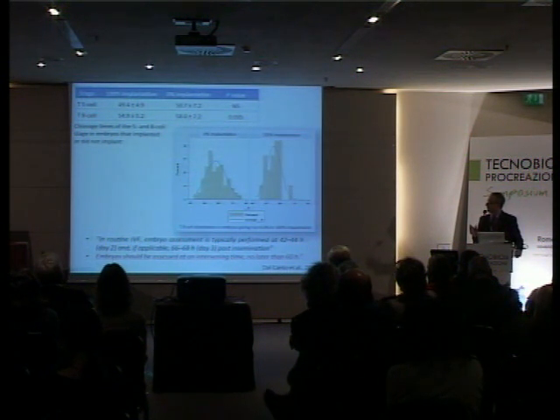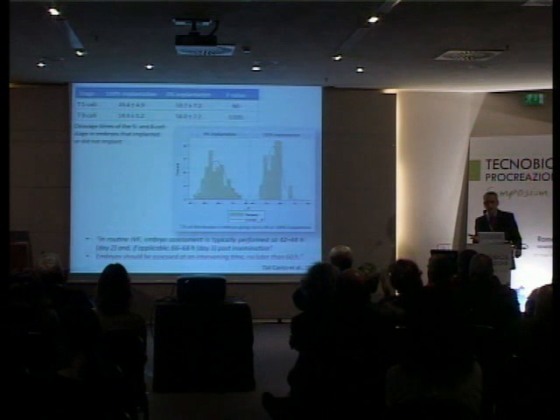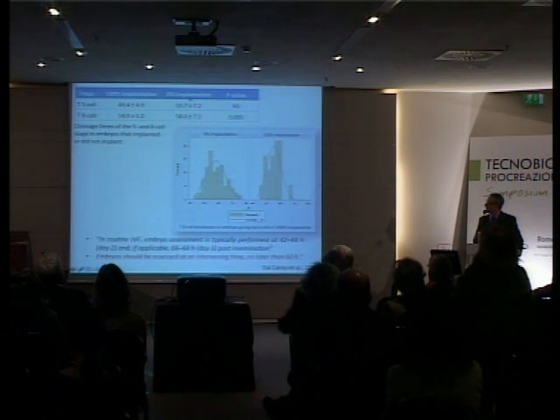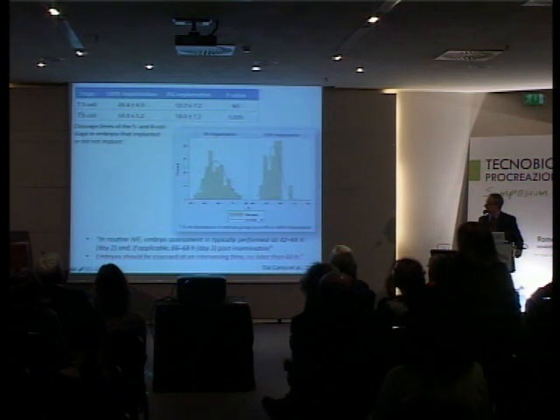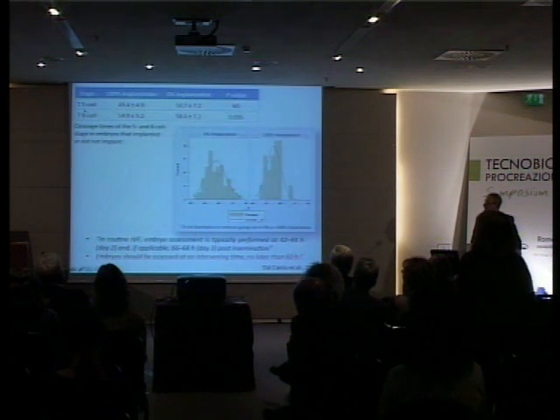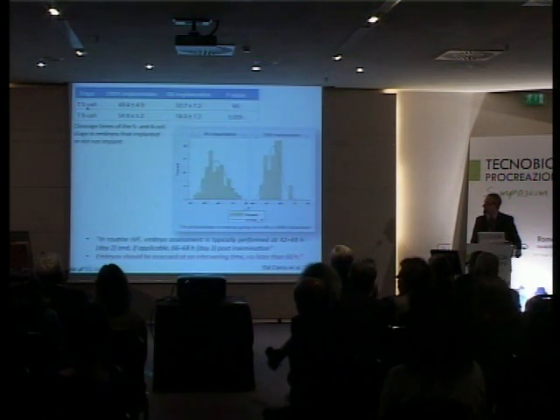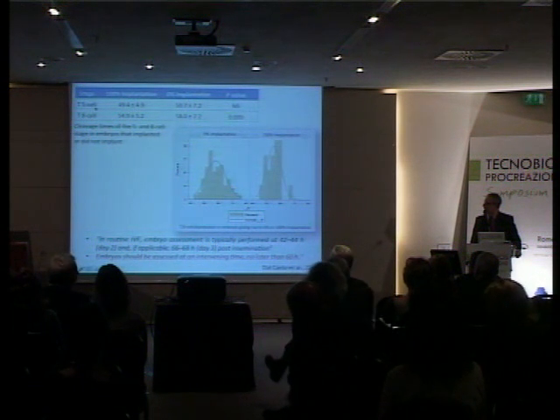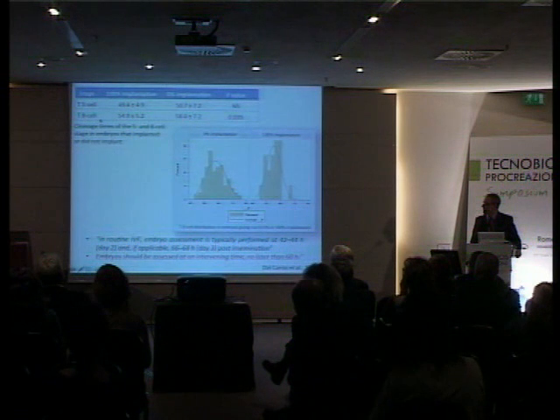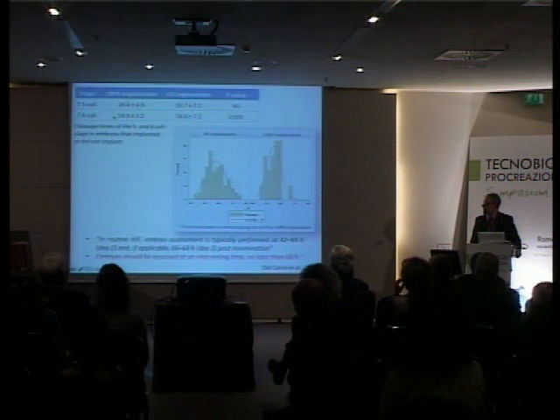And by that, we were trying to better highlight some possible differences. And we compared the 100% implantation with the 0% implantation, limiting the analysis to only 2 time points. One, the ability to reach the 5-cell stage, and the other one, the time required to reach the 8-cell stage, which we believe is important.